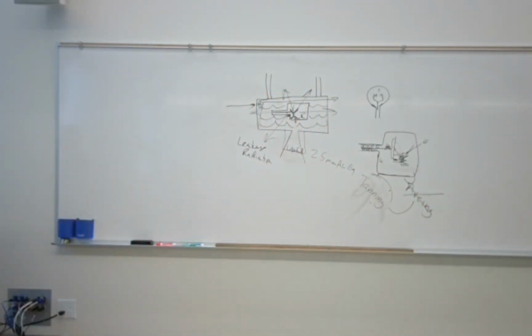So this is what you've got. The cloud of electrons, called space charge, makes it difficult for subsequent electrons to be emitted by the filament because of the electrostatic repulsion. So what you've got there is a lot of electrons trying to bump into each other, pushing each other apart. You've got a limited space, right, to put them. So you can only put so many on it before you can't put any more on it. Your cup is full, right?